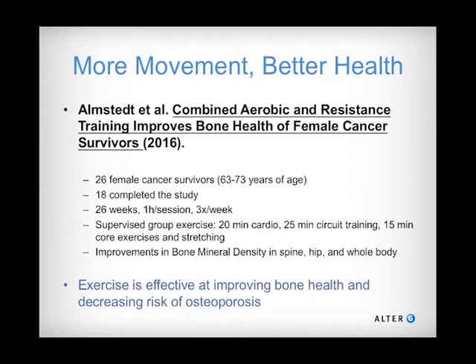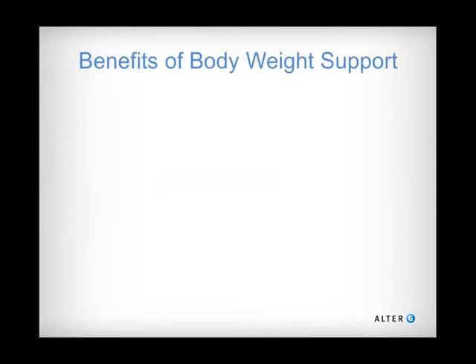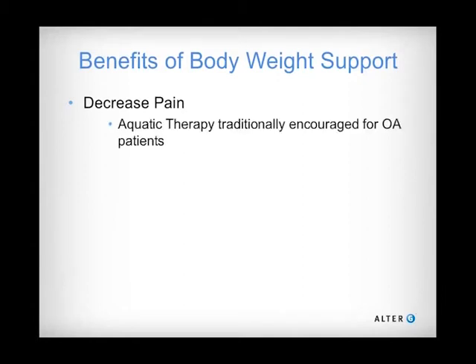If people exercise, they can get through closed kinetic chain activities without pain, and it's going to prove beneficial. So oftentimes what leads to pain is gravity, is weight. So if we can eliminate some of gravity's effects, we can encourage people to move. And body weight support is used already with patients that have these conditions. So elderly patients that have OA, if they're painful, a lot of times physicians may recommend aquatic therapy. You can send them to a pool. They like that. Part of it is a social aspect. They can get in a pool with other patients. They can go to a class.